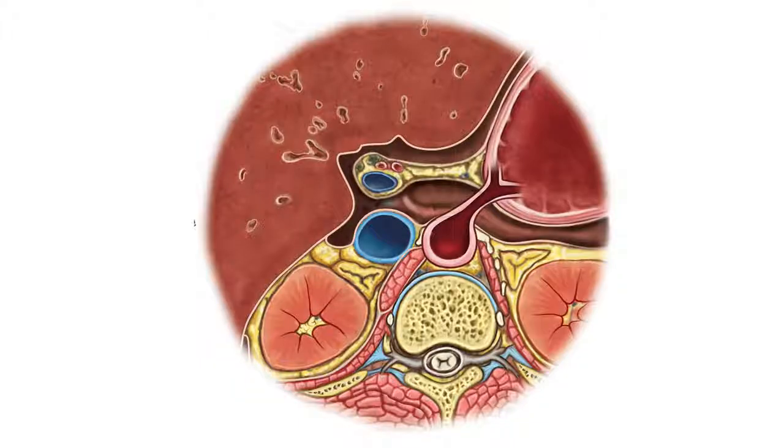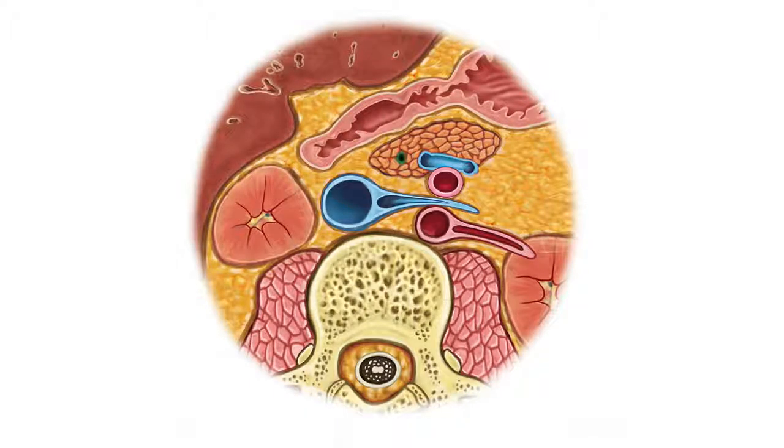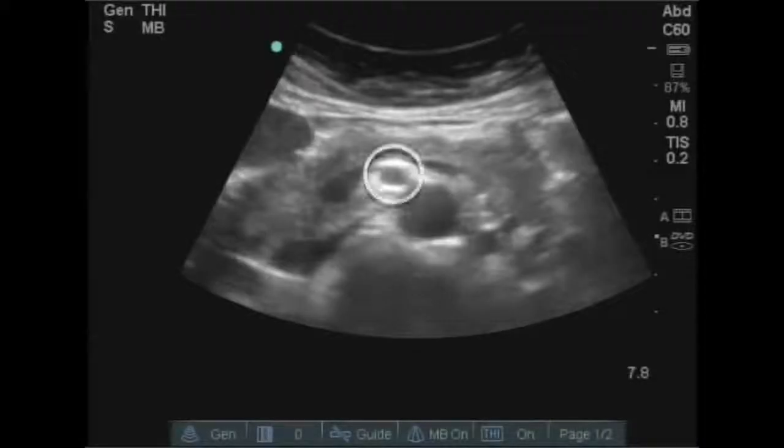the SMA view. While you can start with the celiac takeoff, this is very close to the proximal aorta, and measuring the anterior wall may be difficult with the branch point there. What you may want to look for is down where you can see the SMA in view. And you can see here the SMA anterior to the aorta. The SMA is known as the mantle clock sign, and you can see this anterior to the aorta.